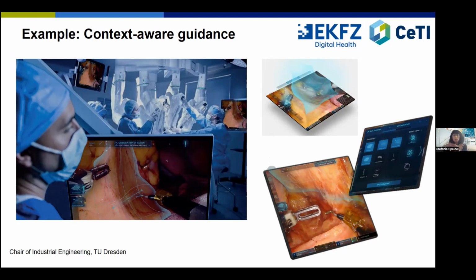And also to implement the transparency is not easy. And you have to adjust different visual parameters. You also have to think about maybe other visual cues to enhance the visualization, for example, also working with motion or inverse realism and so on. And then, as I said before, you also have to make sure that it's not cluttered all the time. So I think either context awareness or activation on demand could be also one means to realize that, because it should not be distracting. It should improve patient outcome in the end and should be meaningful for the surgeon.